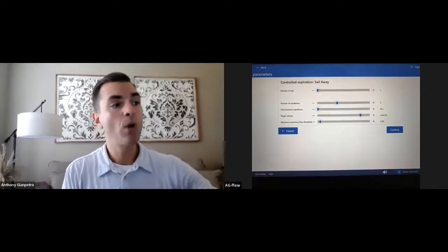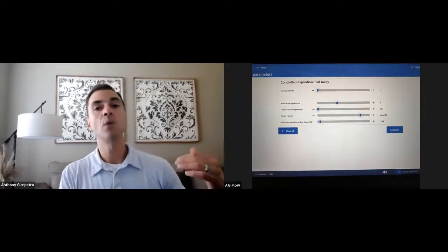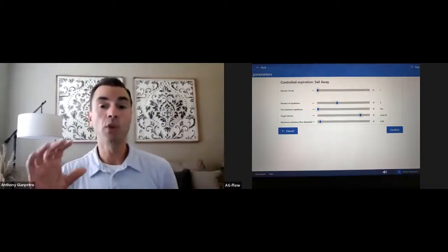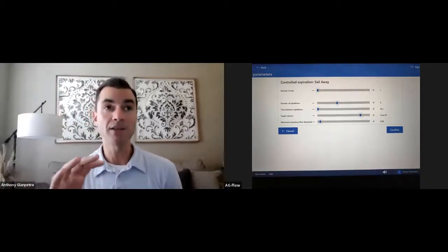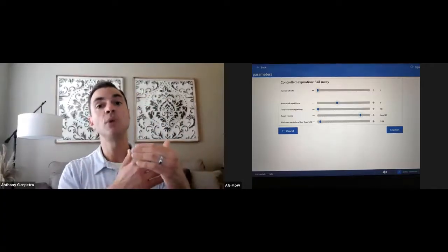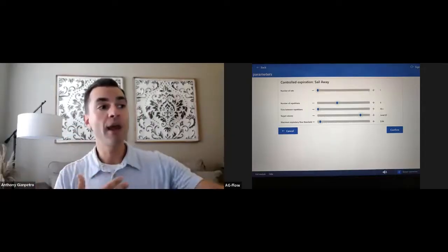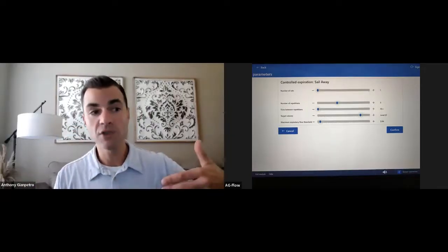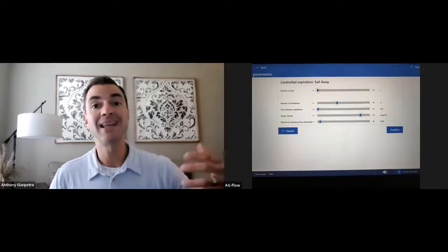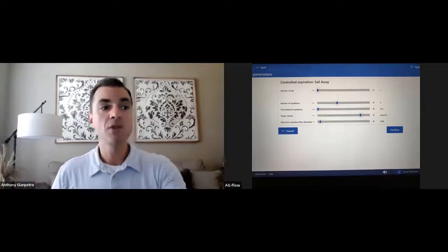But what's this maximum expiratory flow all about? Well, this is what we're talking about with breaking the sail. Much like when we looked at stalactites and stalagmites, if I'm doing this right, you want those set so that the patient is doing a nice, slow and steady approach to inhale. Well, Sail Away is the exact same thing, but in reverse. So you can go after maximum expiratory flow to make sure that your patient is getting the maximal cadence within the volume that you selected. So let me show you what I mean.